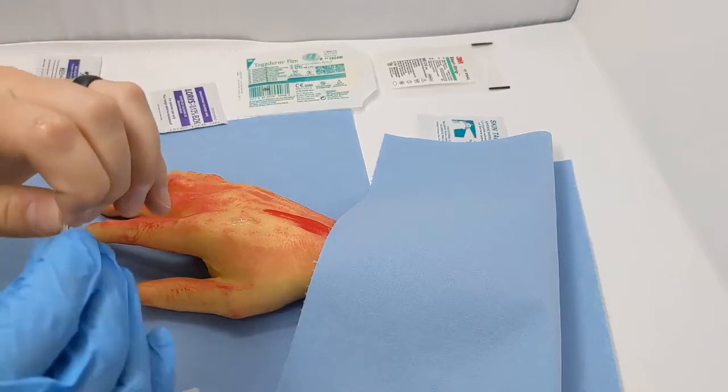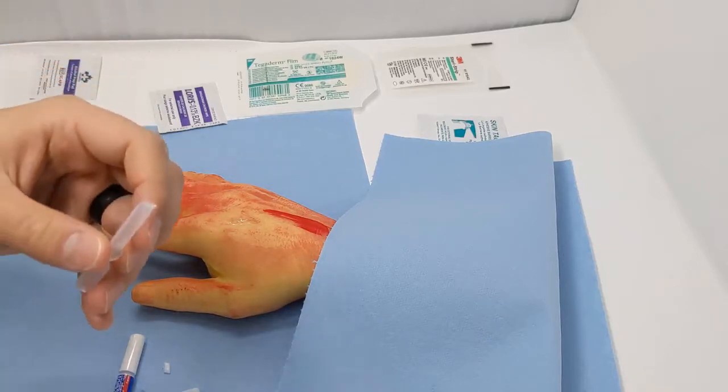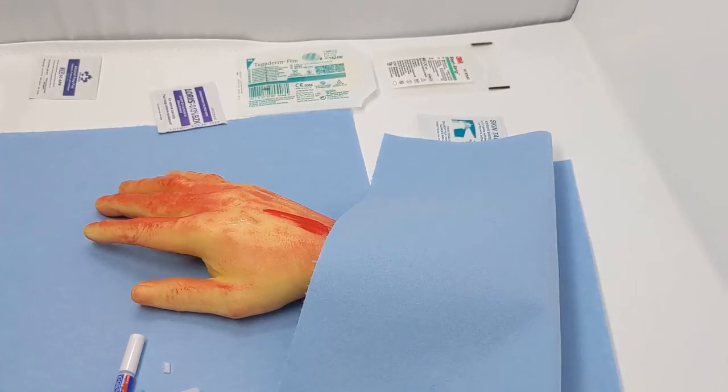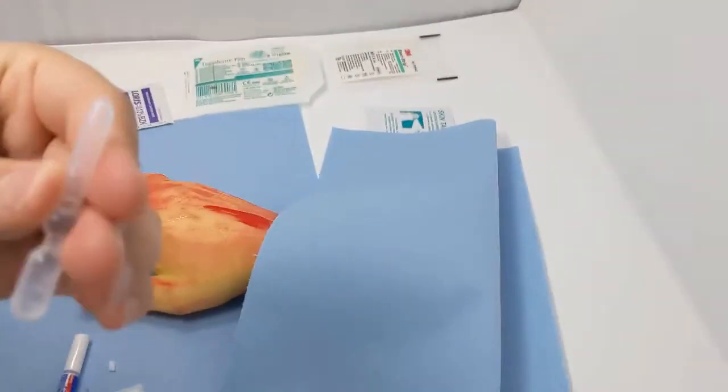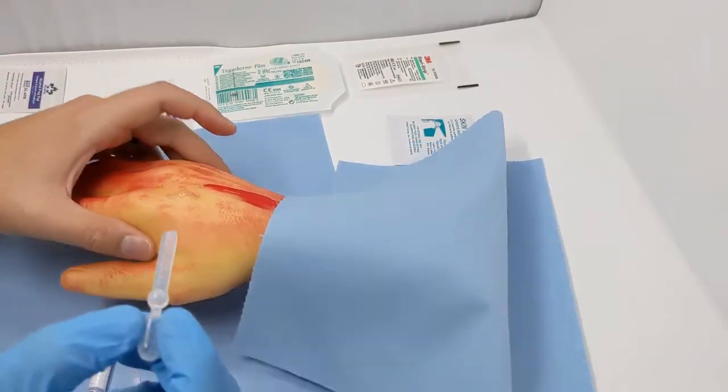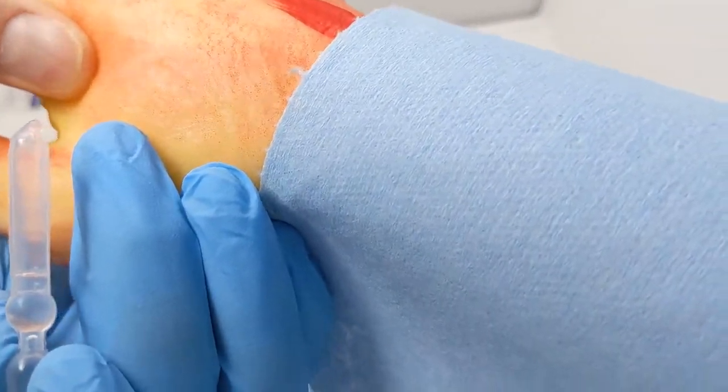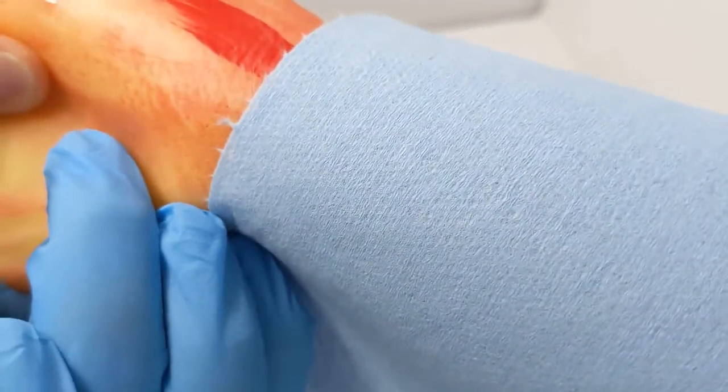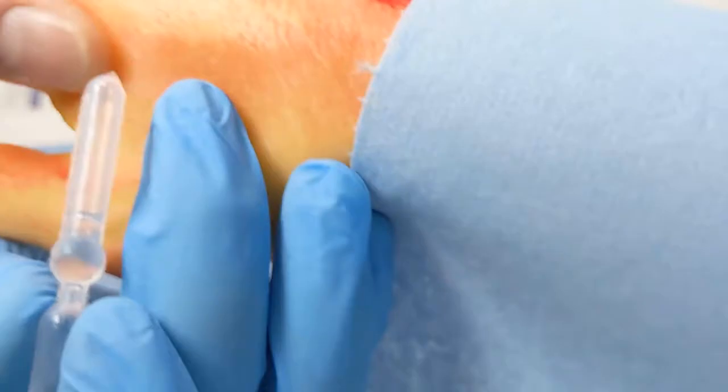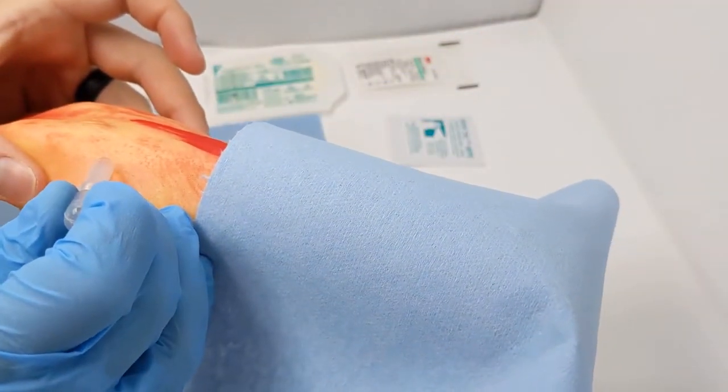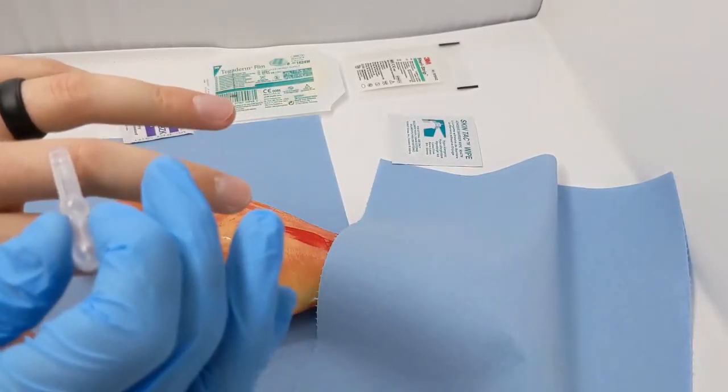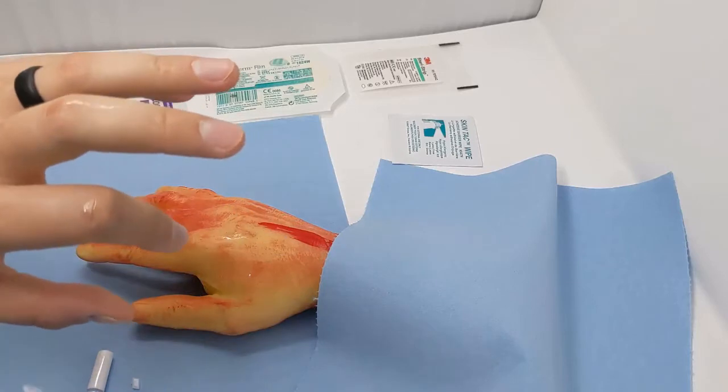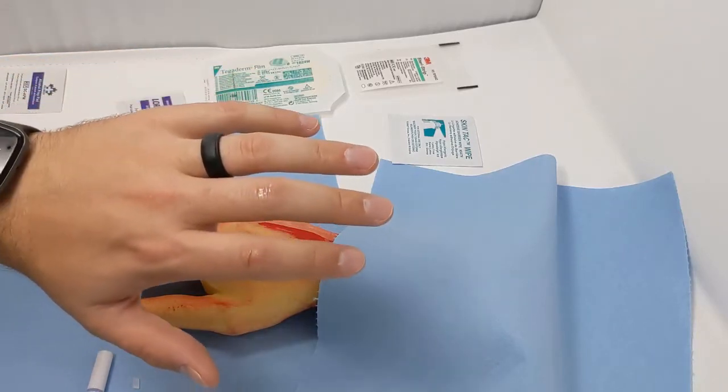Here's the Glue Stitch. This one we're going to have to cut. We'll just cut the end off. Here's our little applicator and this has just a single dose. We're going to glue up this little laceration we have here. There it is, tiny little laceration there. We're just going to add a little bit of glue across. Let that dry. Then I'm going to test this on my finger as well to see the elasticity. I'm just going to run a little length across there.